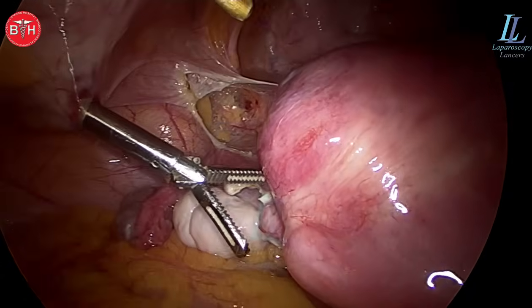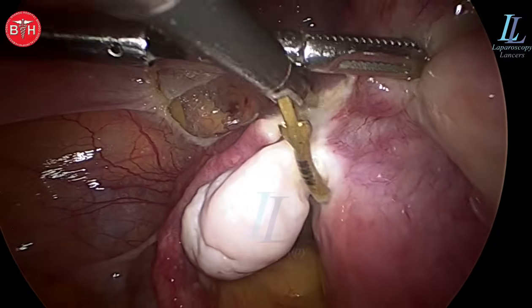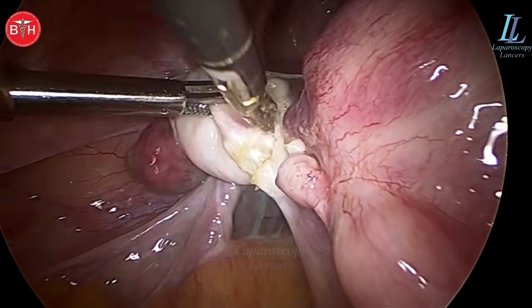The surgery is shown at 2x speed — you can always slow it down to see the steps. I will not be showing the complete surgery as it took around 45 to 50 minutes; I'll be packing it into 15 minutes.